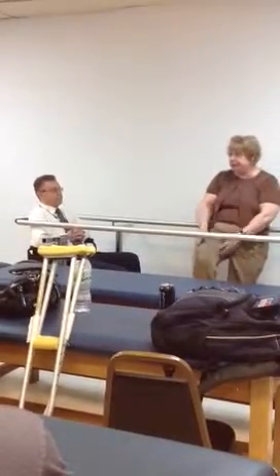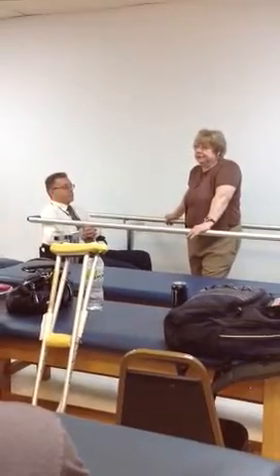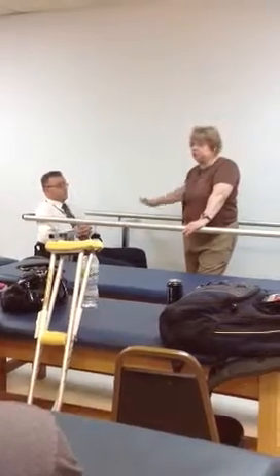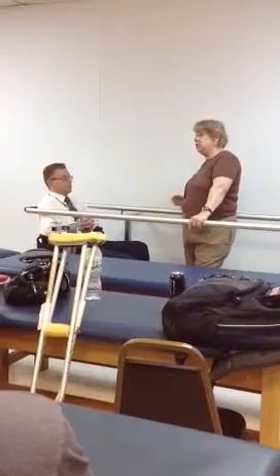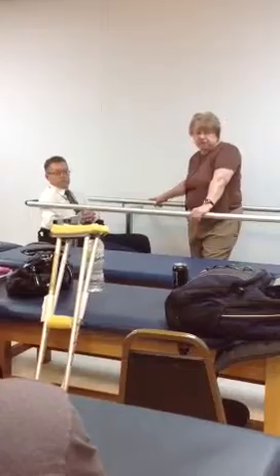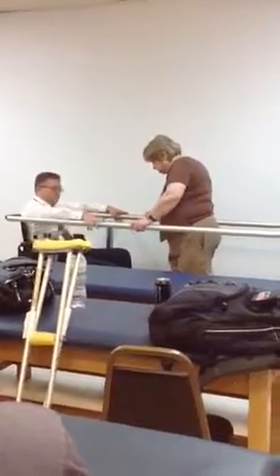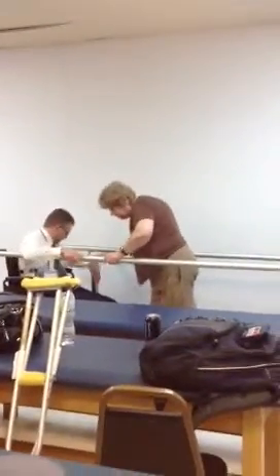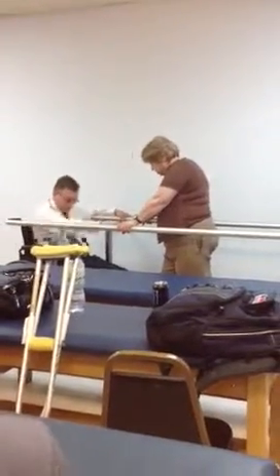to pick it up and lean back. If he weren't, or if he were less physically fit, he might have to hold on with one hand onto the parallel bars. You don't wanna have him reaching, hooking around the push handles because it's gonna get in the way. But since he has the parallel bars, he could always have one hand on the bars and take the other leg off. Okay, now we gotta swing the foot pedals out of the way.